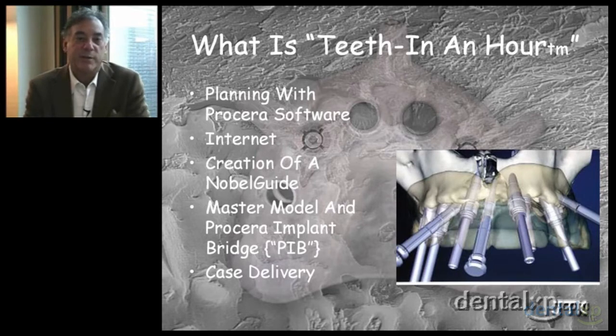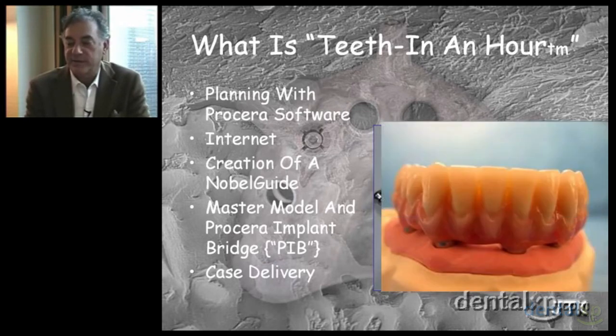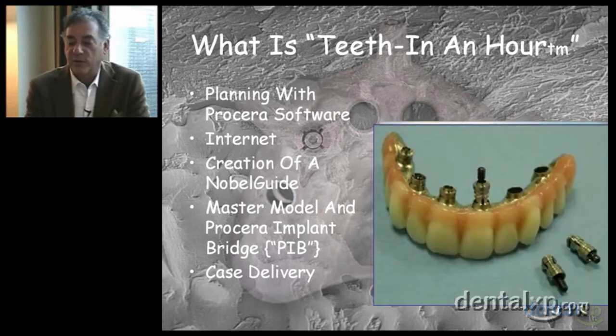We also know that there's a 3.5 implant in the Nobel system, so for that we would utilize an insert into the 4.3, which will give us a three-dimensional positioning of that particular implant size. Again, the intaglio surface is being worked on at the laboratory phase. This would be a master model and a final prosthesis in the lower jaw case.